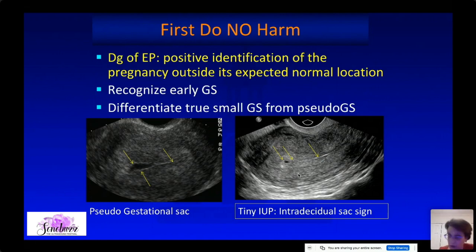However, of course, I don't see a yolk sac. I don't see a fetal pulse. So I cannot comment on the viability of the pregnancy, but I think it's more likely that this patient will have an early IUP, and we just follow the beta HCG.